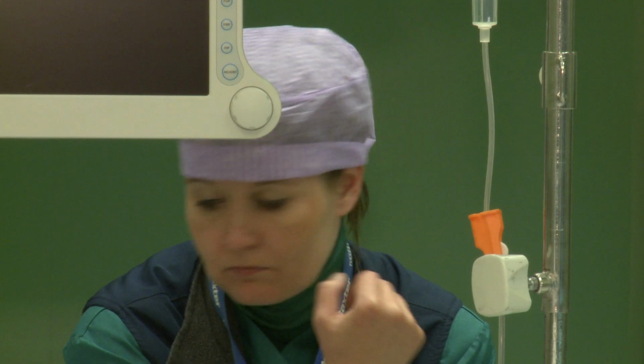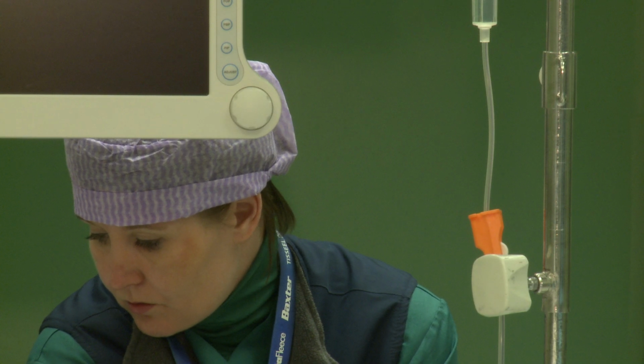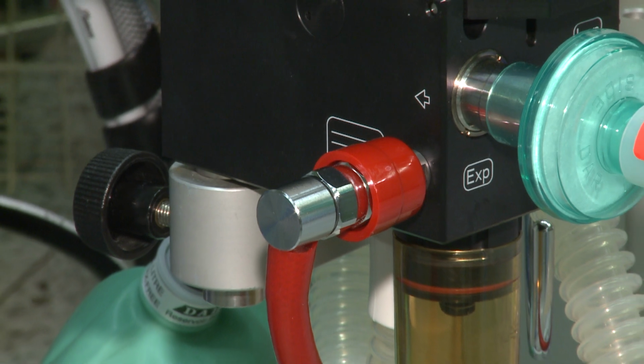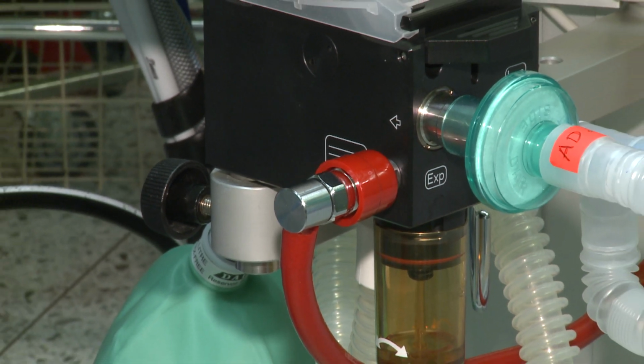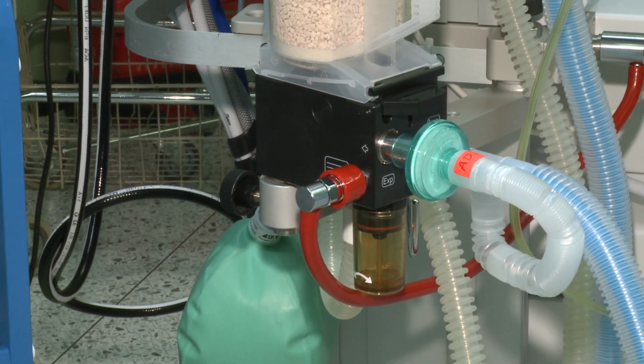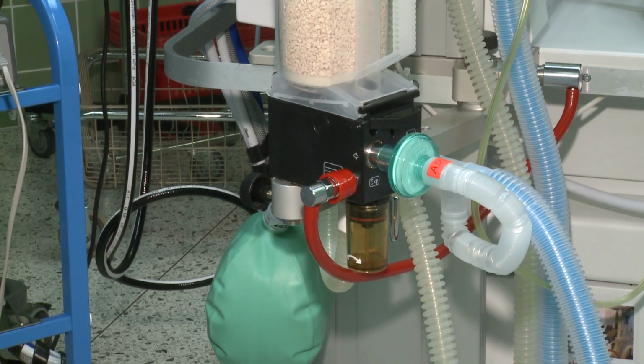If the anesthesia is insufficient for the planned surgical procedure, the options are further spinal anesthesia or general anesthesia. In this case, the spinal anesthesia is sufficient, and preparations for surgery can be continued.